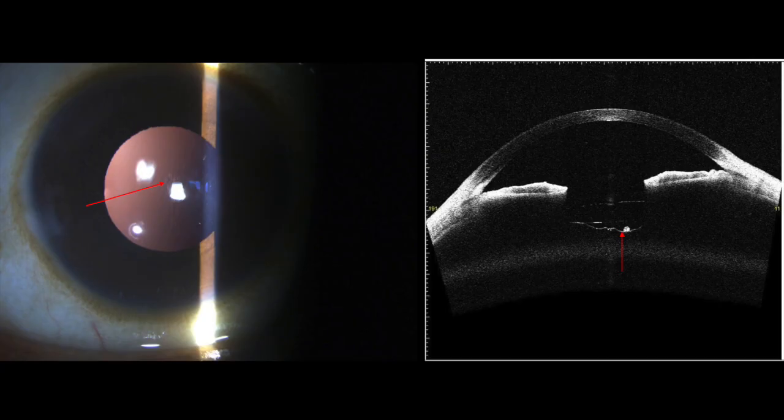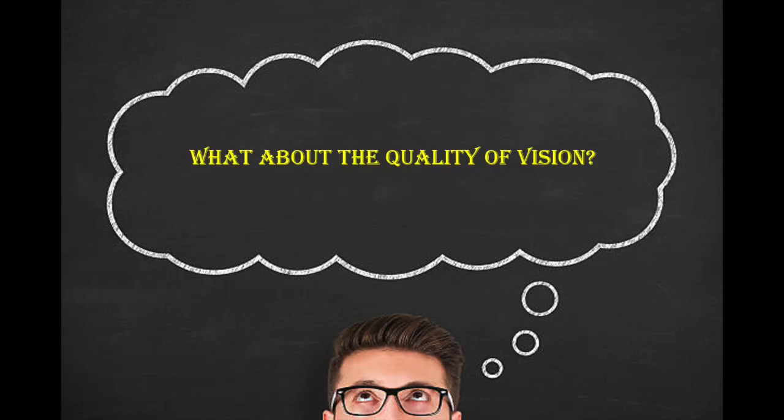Post-operatively after 1 week, the vision improved to 6/12 with an absolutely centered IOL in the bag. Anterior segment picture as well as the anterior segment OCT shows folds in the posterior capsule. But what about the quality of vision?